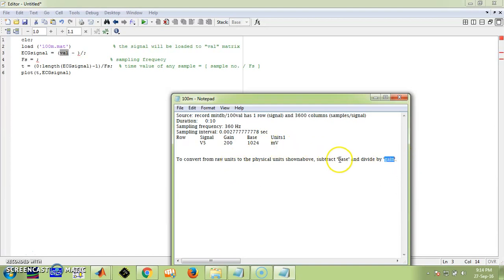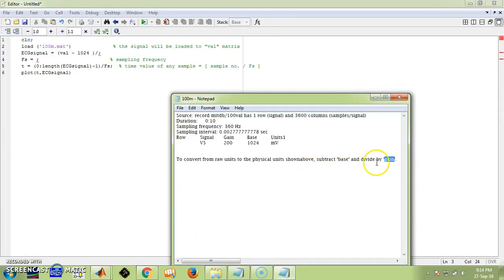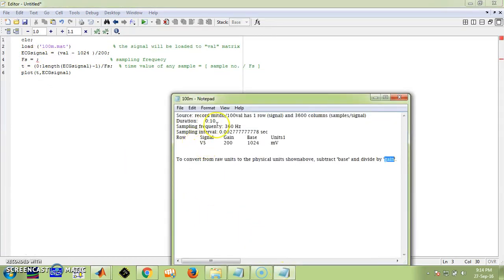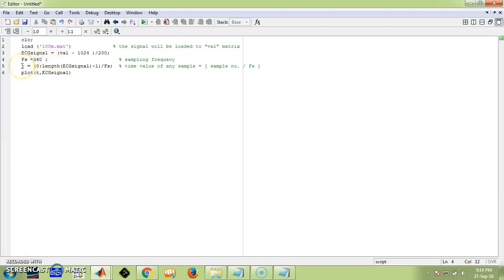To convert, we need to subtract the base from this particular database and divide by the gain. Subtract the base, which is 1024, then divide by gain, which is 200. The sampling frequency given is 360 Hz. This data provides information for just the Y-axis — the magnitude axis of the ECG plot. We need to consider the time axis also, so for the time calculation at different instances, the time value of any sample is just the sample number divided by the sampling frequency.